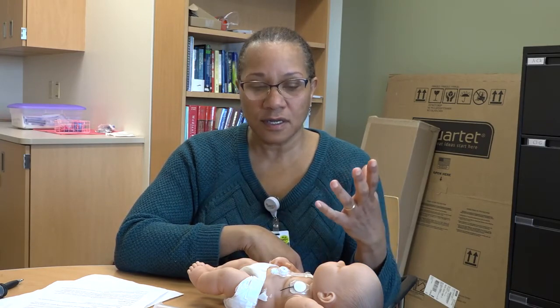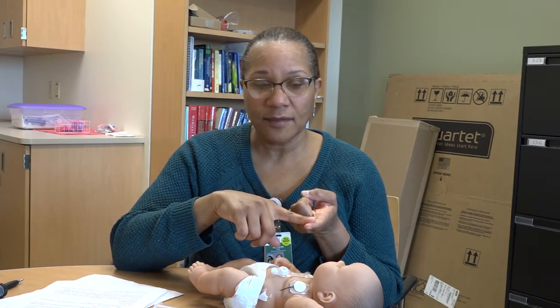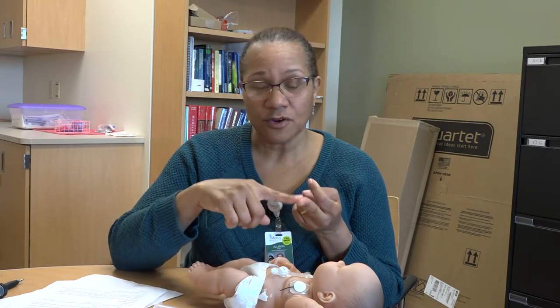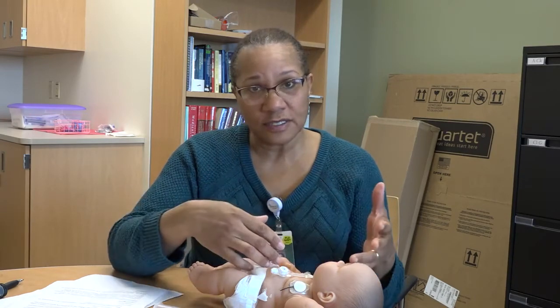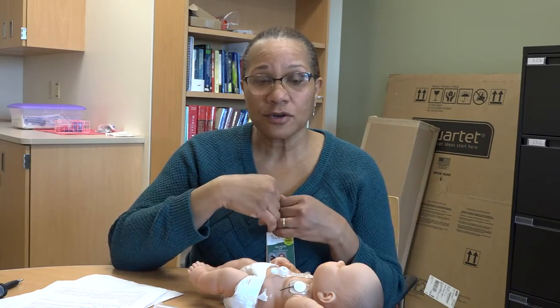Third reason why you can see more leakage has to do with any increase in pressure in the tummy. And that would come from coughing. So if the baby happens to have a cold and they're coughing a lot more, you're going to see more leakage from that area. If they're sneezing, once again, increase in intra-abdominal pressure, you're going to see more leakage because that fluid's going to take the path of least resistance, and that's going to be out of that hole. If your baby has been vomiting, you're liable to see more drainage with that also. For some children who are on vents, the increased intra-abdominal pressure that comes from being on a vent can cause more leakage to occur also.